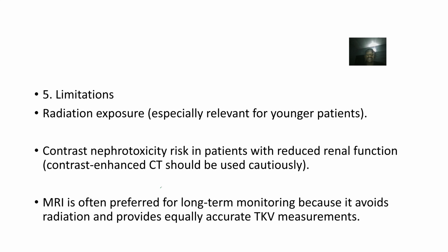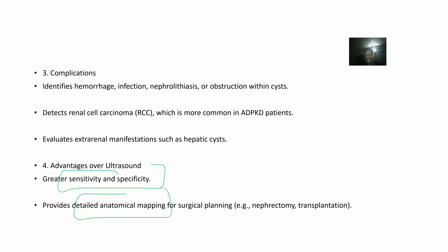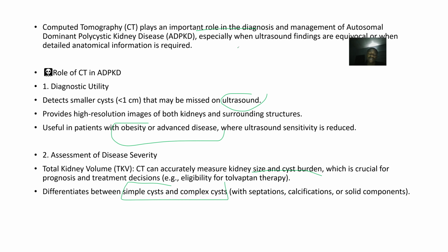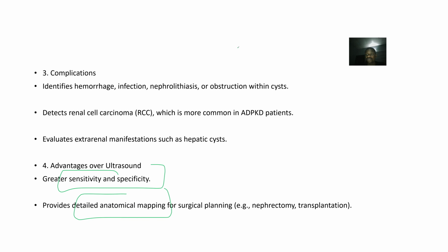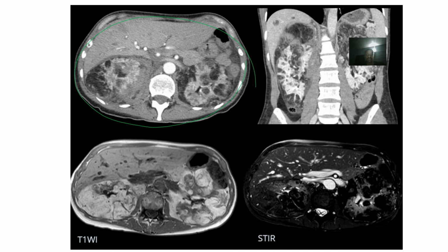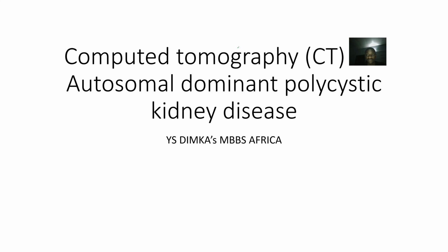But the limitation is that you are exposed to too much radiation, and you may receive contrast. The contrast is injected so that the image will be clearer. But those contrasts could actually be nephrotoxic, toxic to the very kidney that you are trying to manage. Do you understand? But by and large, that's what we have for CT scans.